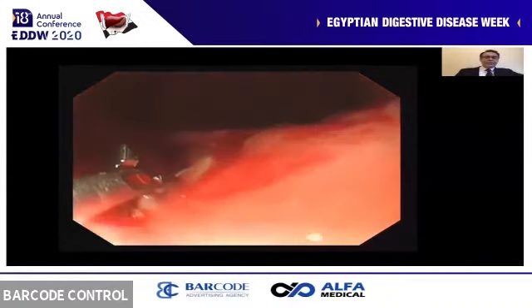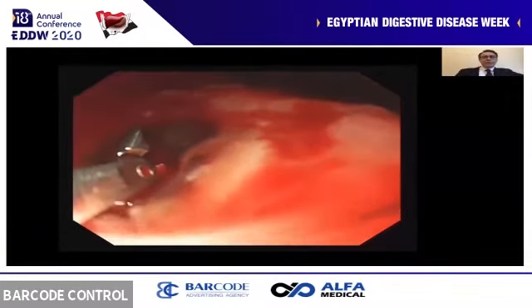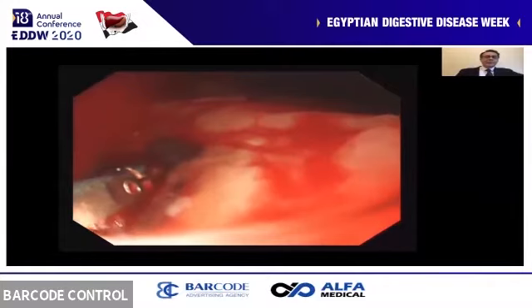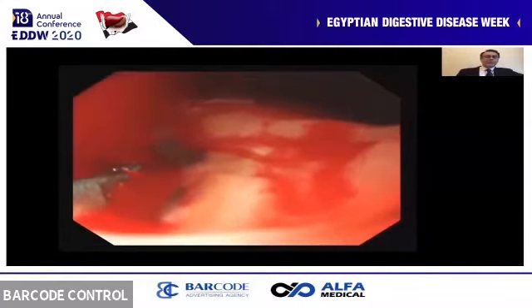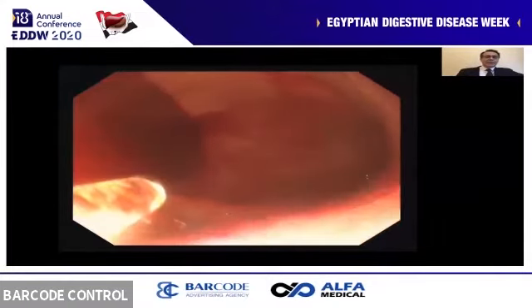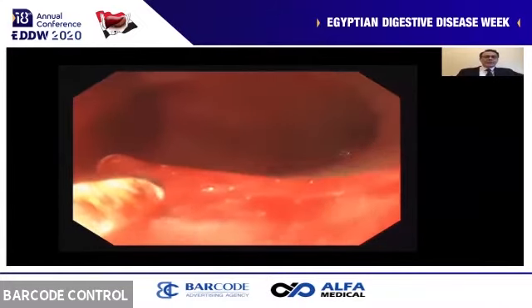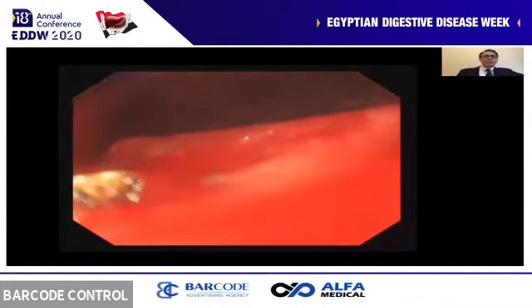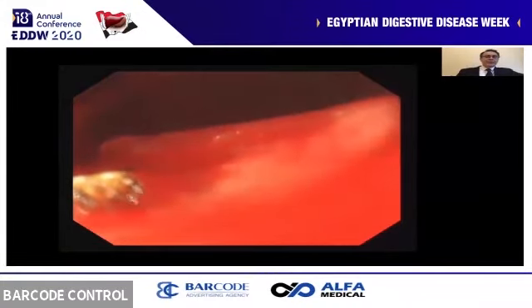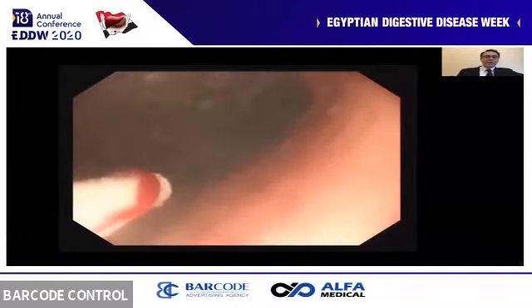However, it did decrease the volume of the bleeding, but the bleeding persisted. And I'm sorry because the video doesn't show clearly the effect because it's been edited and they made a short version, but it still continued to bleed. So then I used a bipolar probe. This is a gold probe, which did stop the bleeding, but I felt more confident applying additionally a topical method such as a hemospray.